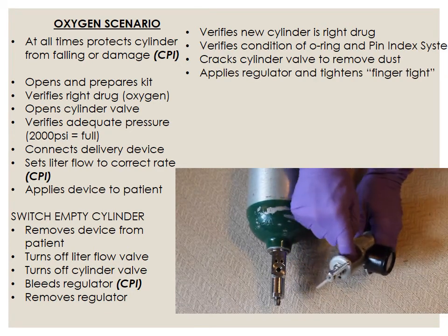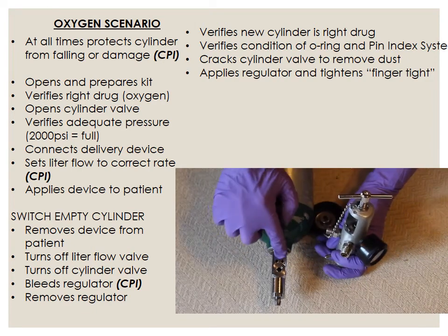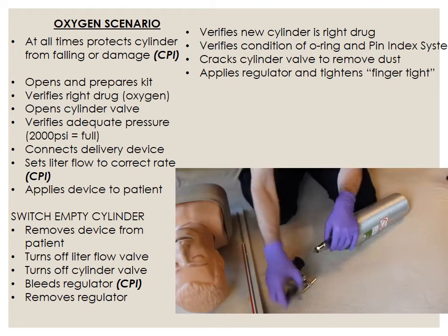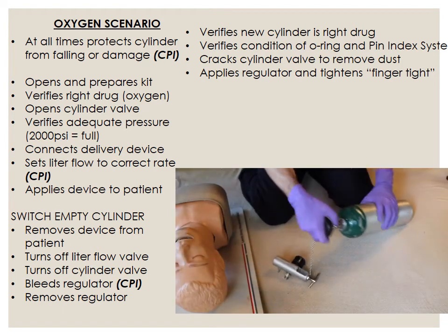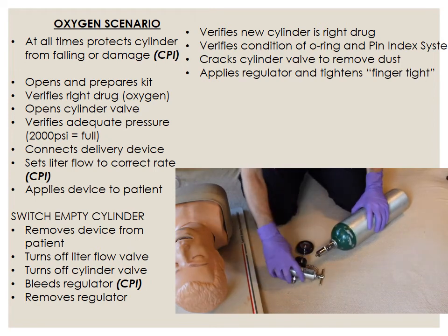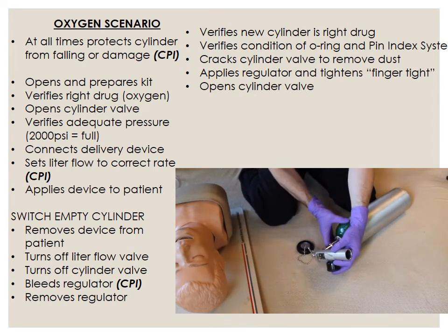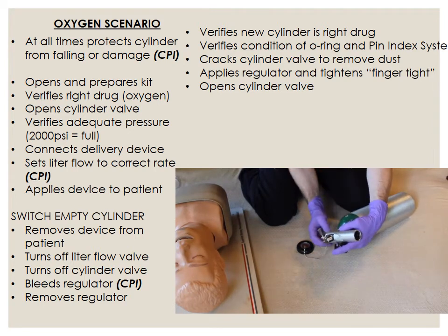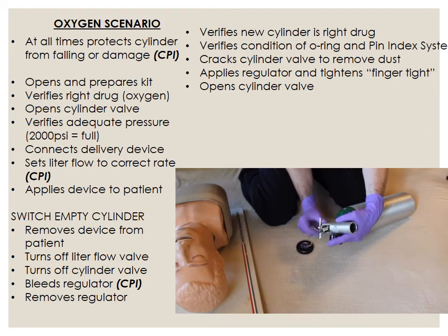Verify the condition of the O-ring and the pin index system. Be sure that it matches your new cylinder. Crack the cylinder valve to remove dust. Apply the regulator, align the pins, and tighten finger tight.